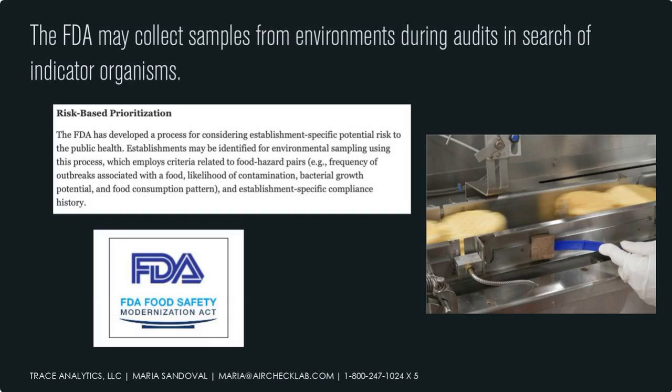And they also use what's called the BAM, the Bacteriological Analytical Manual. It's basically a chapter book that you can go through, and it has all these methods and all these different ways you can sample foods and cosmetics and liquids. So that's definitely public knowledge, so you can definitely go online and just download some of that.